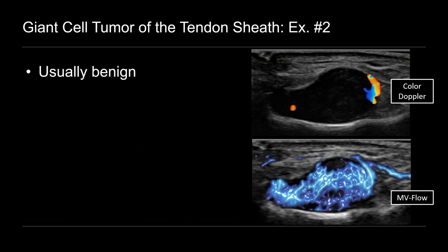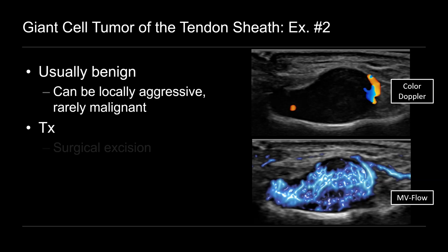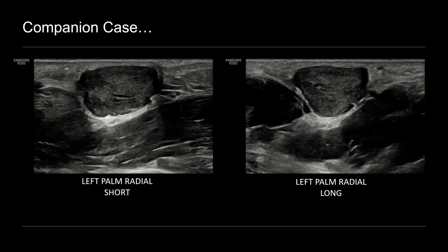These tumors are usually benign. They can be locally aggressive and very rarely malignant. The treatment is typically surgical resection. Let's look at a companion case. This is a patient that presented with a mass at the radial aspect of the palm — so again, we're on the ventral aspect — and we see this hypoechoic solid-appearing mass with lobulated margins. There's the underlying hand and thenar musculature.